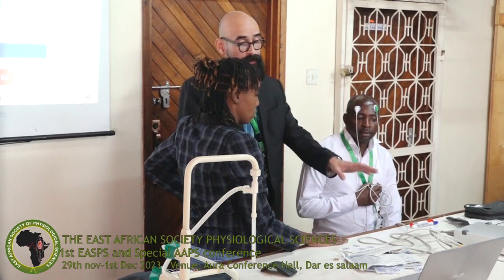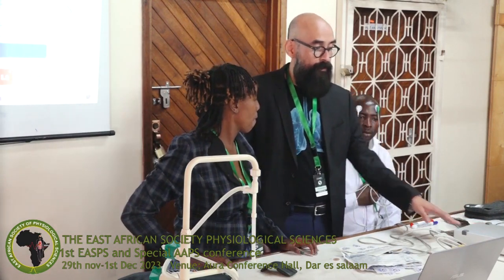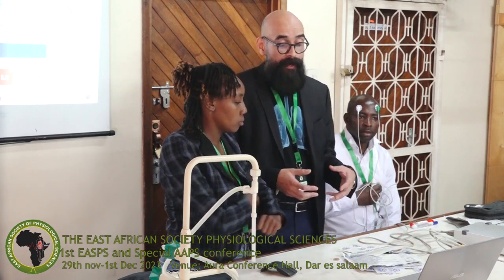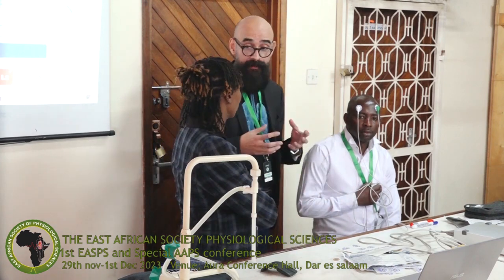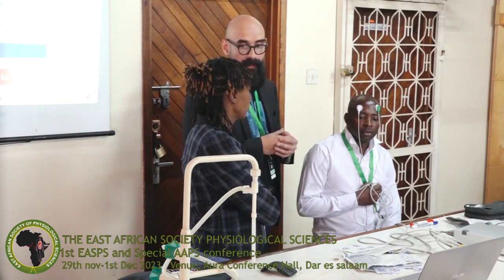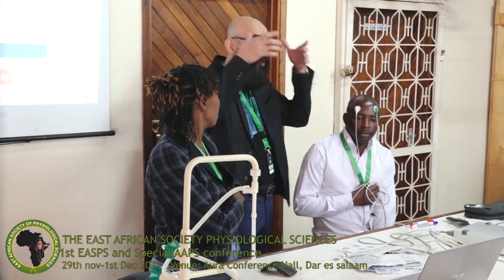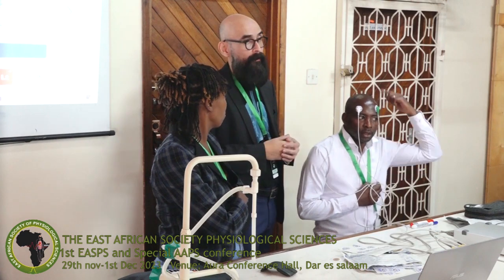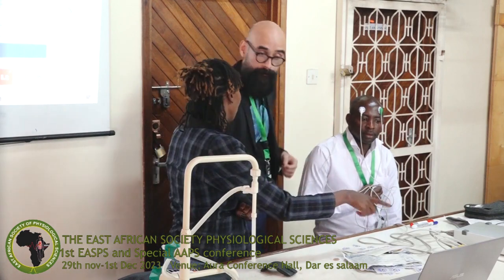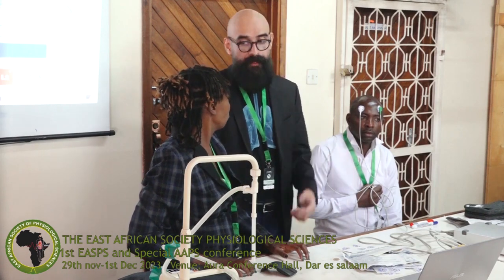No, this is for teaching. This is only teaching. So this one can't be used? No, because the maximum activity that you can get in terms of biopotentials is two. It's a dual biopotential. For a more robust EEG analysis, you need at least 32, 64, 128 electrodes. Those are the ones that you will have in an EEG cap. They usually will be placed on the whole head. And then you add conductivity gel. This one no, but we have research-grade PowerLabs that can.